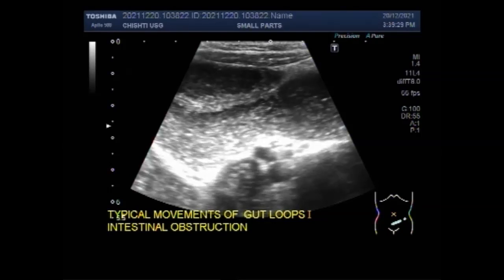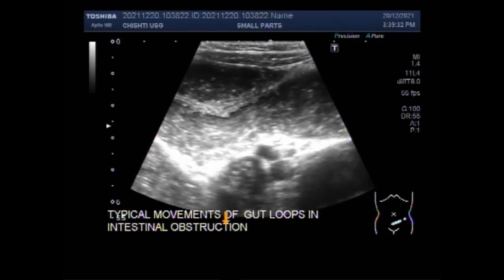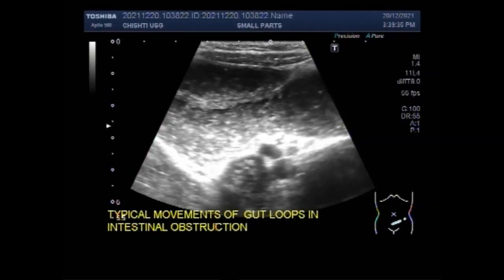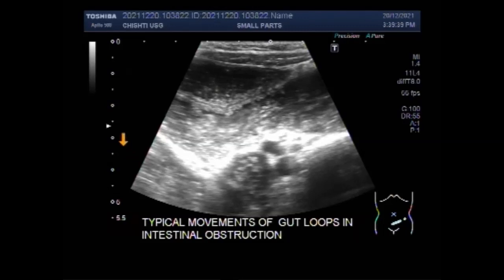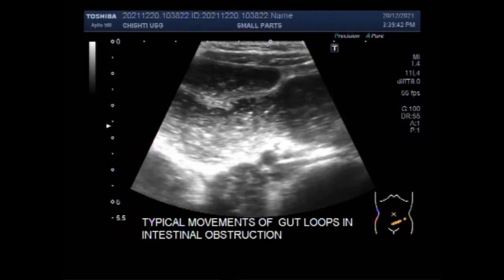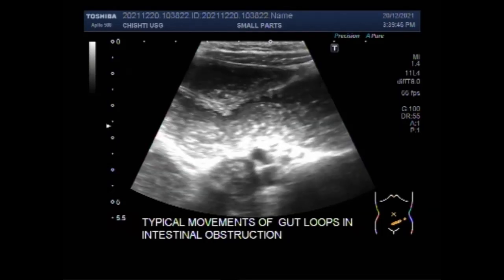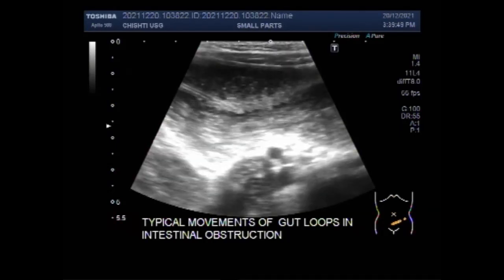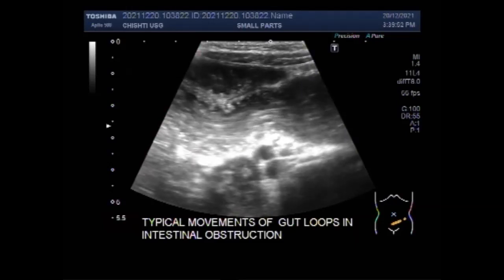Typical to and fro movements of the intestinal contents are seen because there is obstruction. The intestinal contents cannot pass further downwards and they come back, so to and fro movements of the intestinal contents are seen.